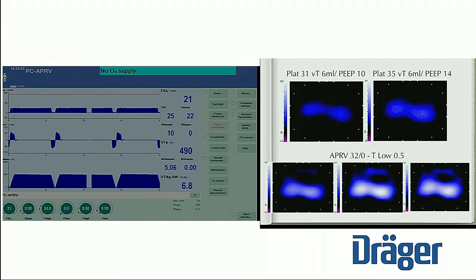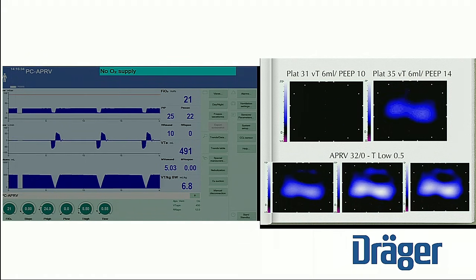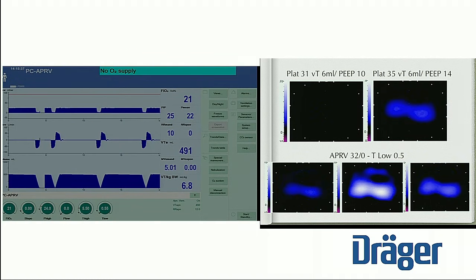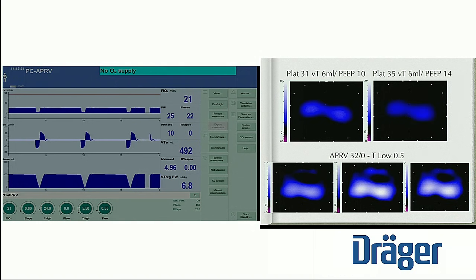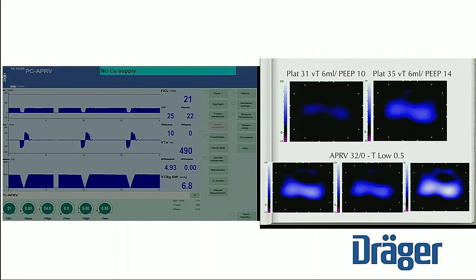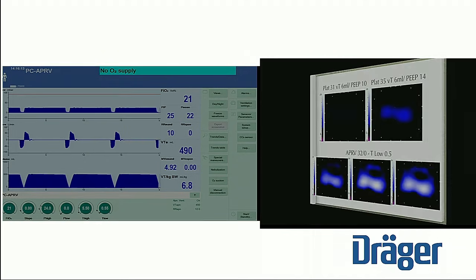Some quick EIT: this is a plateau of 31, 6 mLs, 10 of PEEP. You can see that we don't retain the image on the screen, and as you add more PEEP, of course you do. But when you look at APRV, you'll notice that aeration is maintained even though you're using a P-low of zero. In other words, we maintain the gas volume in the lung. In our studies with injured lungs, it takes 24 cmH2O PEEP to produce the same alveolar expiratory stability as a T-low set to 75% in an injured lung model — so you can save some pressure, meaning your total pressure may not be as high.